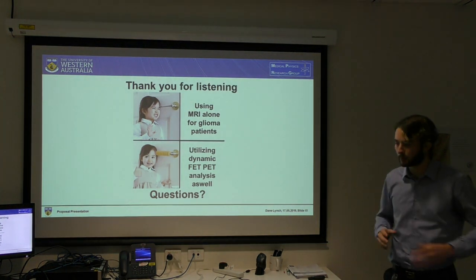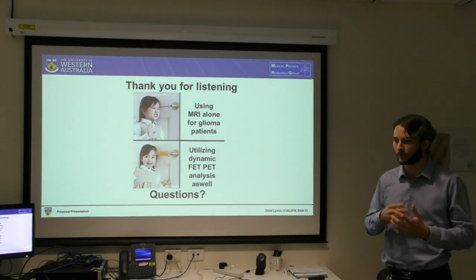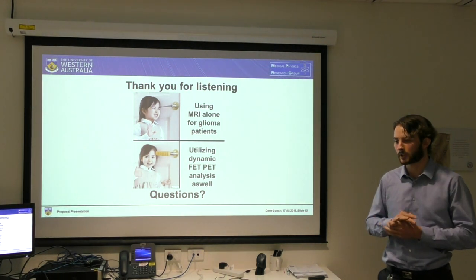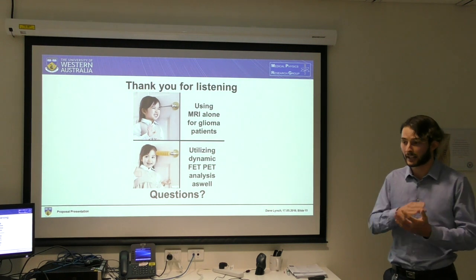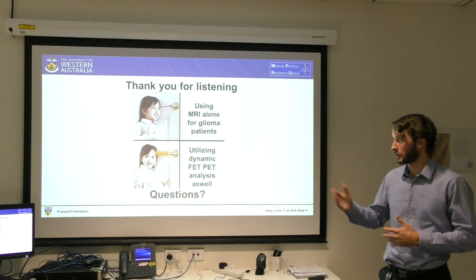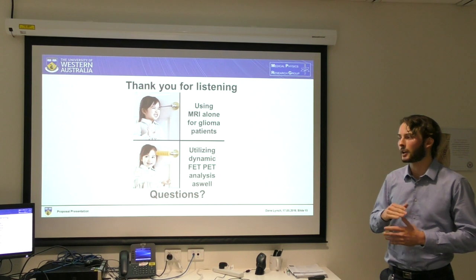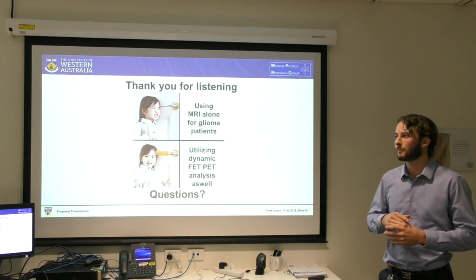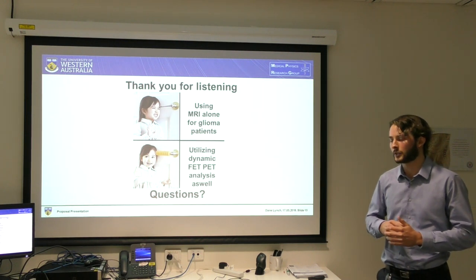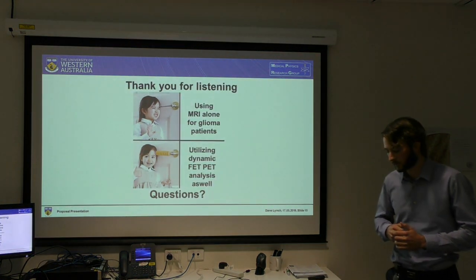So the most important thing is accurately segmenting where this artery or vein is to attain as accurate a plasma concentration curve as possible. Because that gets applied to every single voxel value, because I'm going to apply this Patlak analysis voxel by voxel throughout these images. And it's going to be very important to find as accurate a concentration curve as possible, otherwise it'll just generate a huge amount of uncertainty in these Ki uptake values.